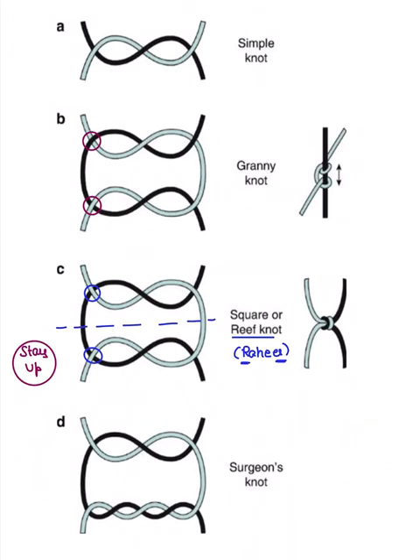See, simple knot, it's very easy. Okay, then see surgeon knot. So surgeon knot, what do you see, guys? You have multiple loops. Okay, many loops. Loops are not uniform, guys. One has a smaller number of turns and the other has more. Why? Think like a surgeon has to get multiple degrees, first MBBS, then MS or MD, then something like DM. So like a surgeon having multiple degrees, it has more loops. That is the surgeon knot. Simple knot is very easy. Now the real problem comes, guys.